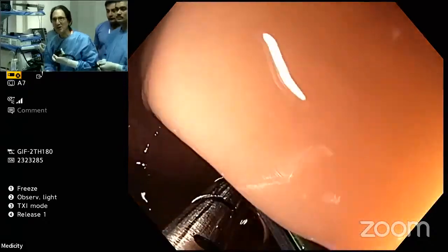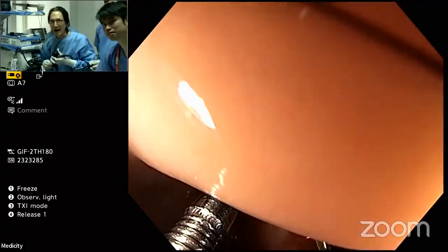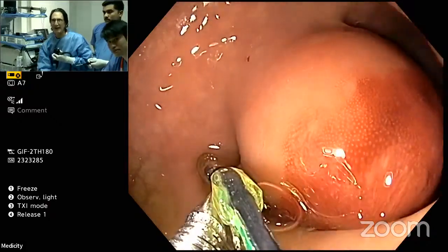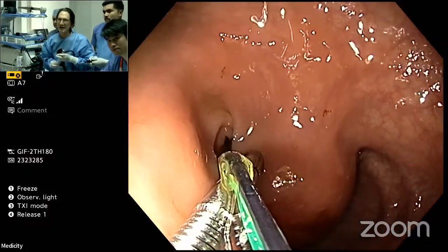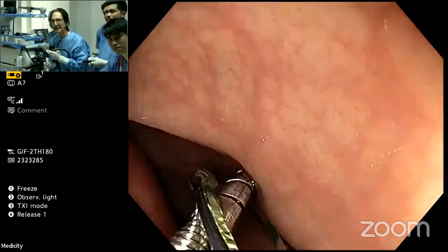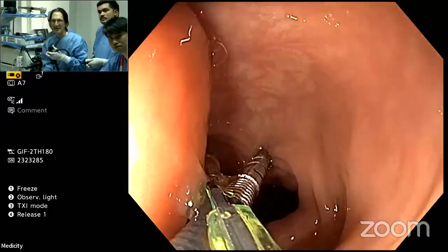So now I'm going to push and I need someone to hold my scope. I'm going to push the 3-prong grasper through the loop, right? Like this. And I'm going to now pull the loop back like this. And I'm going to get a little bit more distance away, maybe rotate a little bit to get into a better position. Now you want to make sure that your loop is recessed back far enough. Let's do this again because I just slipped out, but I'm going to push it forward like this, get a little bit further out so I can pull the loop backwards. All right, like this.